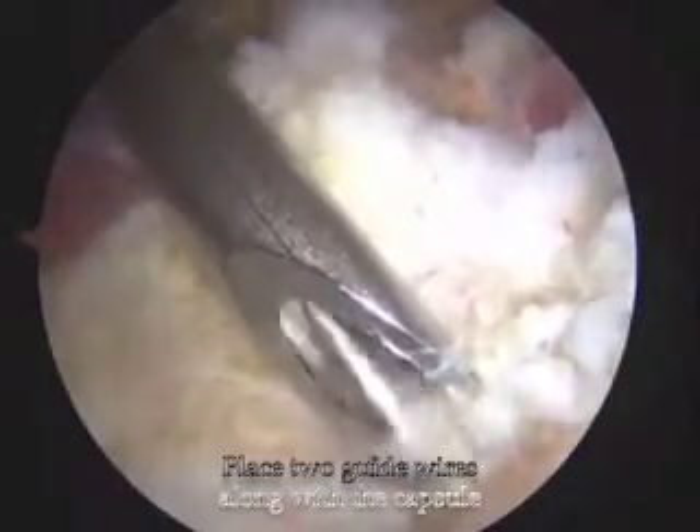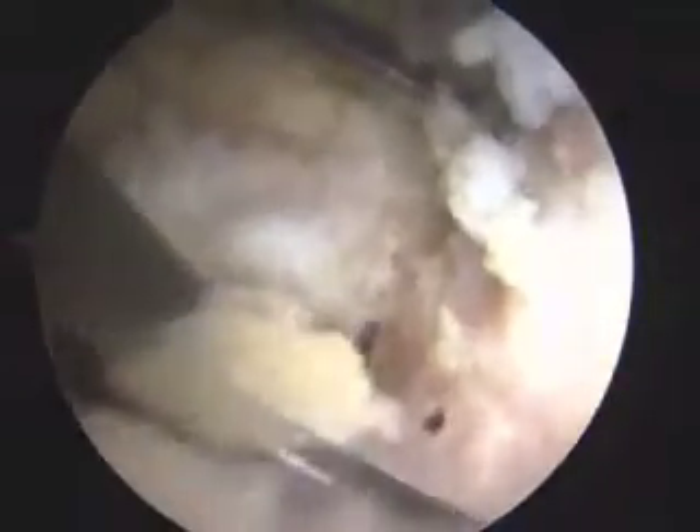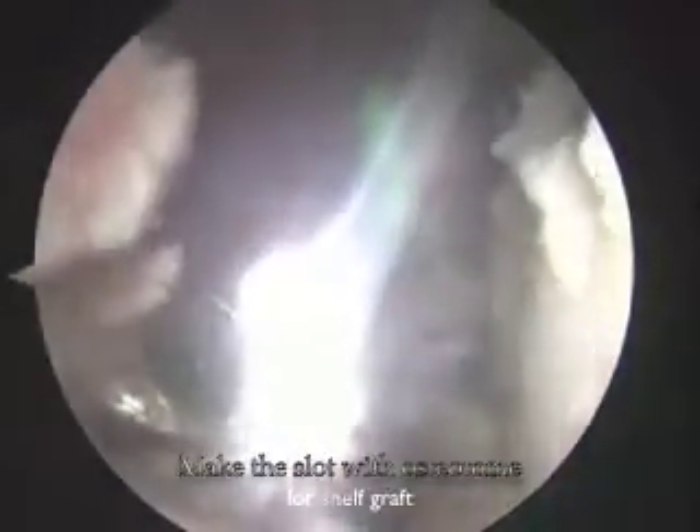We extend the mid-anterior portal to 3 cm length and introduce two 2.4 mm guide wires through this portal. After evaluating the location and angle of the guide pins under fluoroscopy, we introduce the osteotome along the guide wires into the rim to make a slot for the shelf graft.